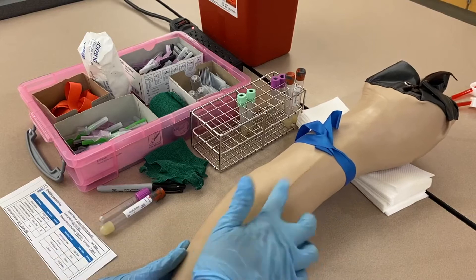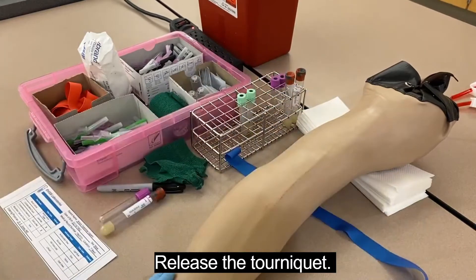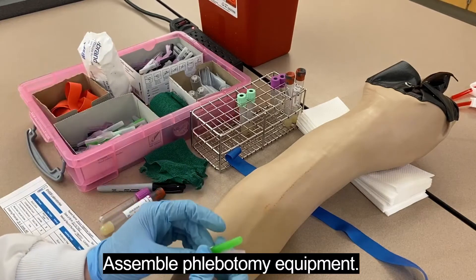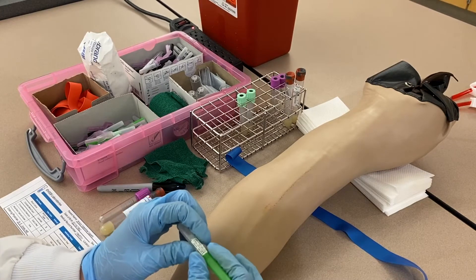We found a good vein, so I can use a regular needle instead of a butterfly. Release the tourniquet so we don't get hemoconcentration of our sample. Now I'm going to assemble my tube holder with my needle. This is a 21 gauge needle, which is one of the bigger ones.